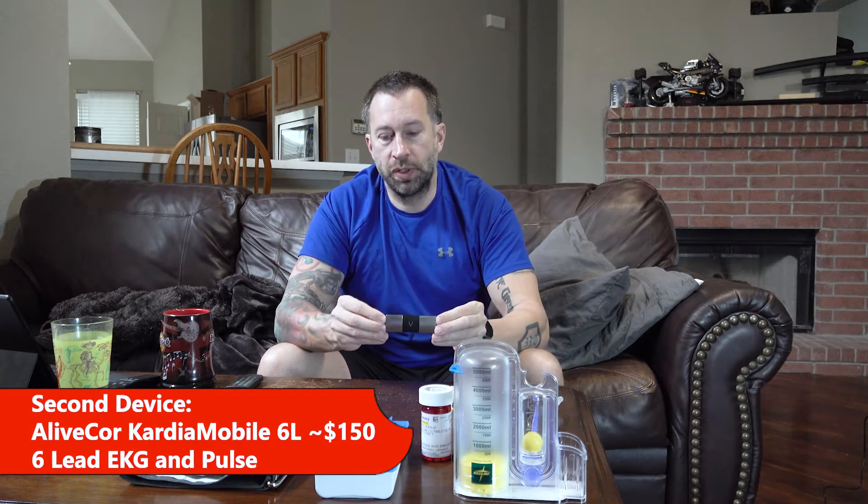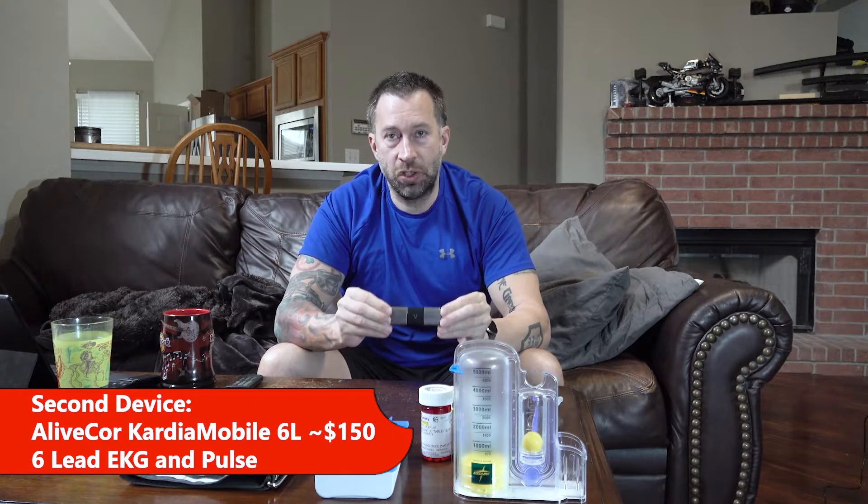The second device is the KardiaMobile 6L, which is actually equivalent to a six-lead EKG. Years ago this wasn't available as a home option, but with my heart rhythm still all over the place it's been very critical — not only for my own peace of mind, but the charts it generates have proven useful for emailing to doctors, letting them see what's going on and determine next steps: should I go in for a cardioversion, give it a couple of days, what's my actual rhythm? It saves a doctor visit and saves time in diagnosis and treatment.